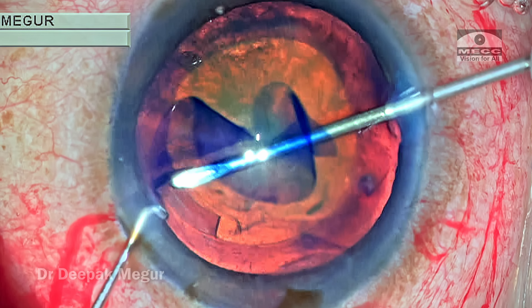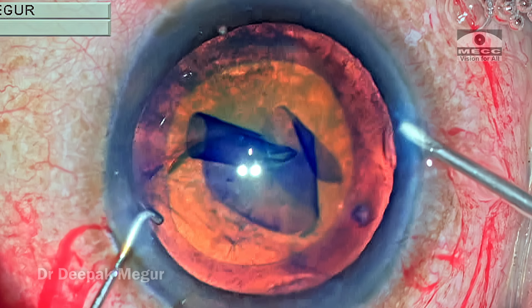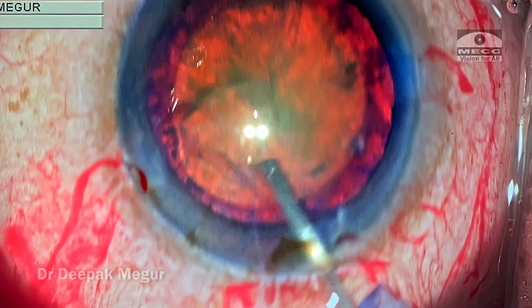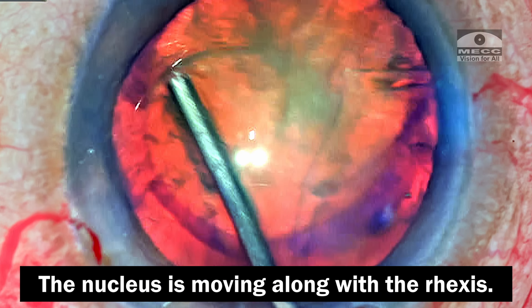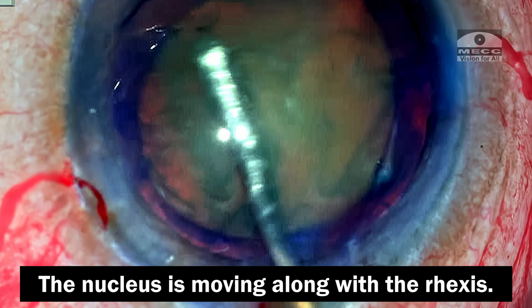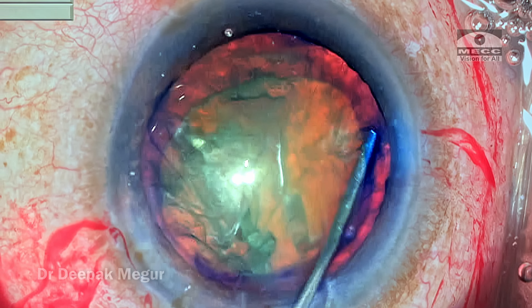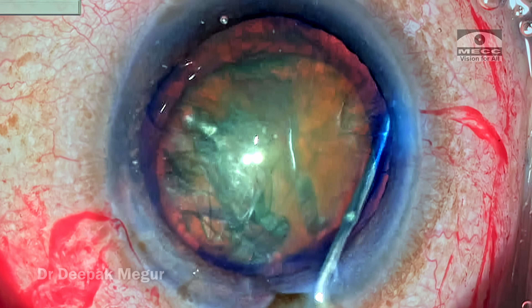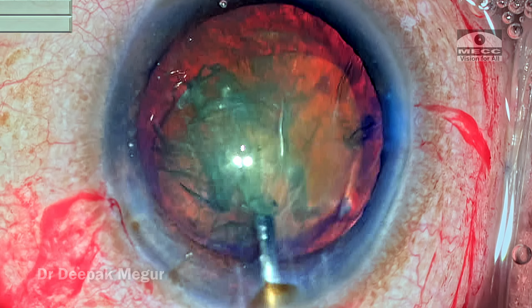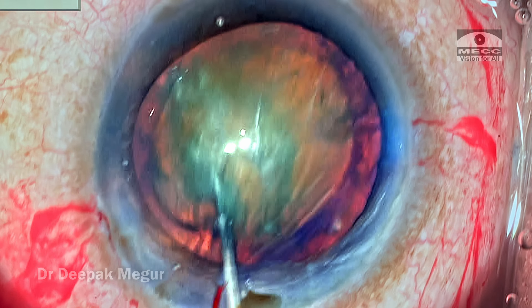The rhexis is done — it seems round, central, and appropriately sized, so no issues there. I'm doing hydrodissection, tapping the lens down and nudging it around. I notice the right side of the bag is still sticking onto the nucleus and moving as I nudge it, so I repeat hydrodissection in another quadrant, decompress the bag, and nudge the nucleus to confirm all corticocapsular adhesions are broken.